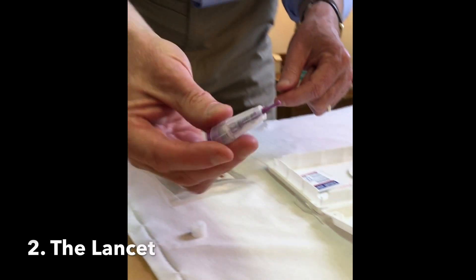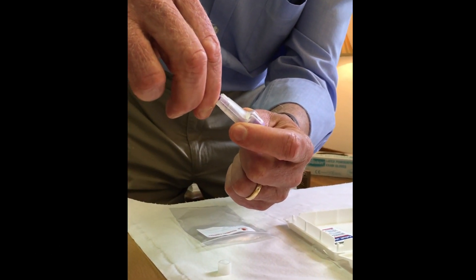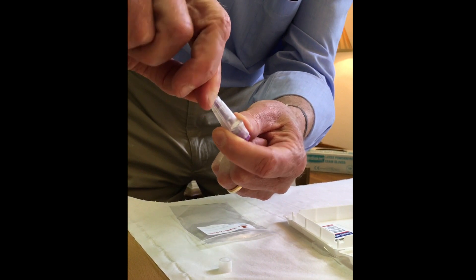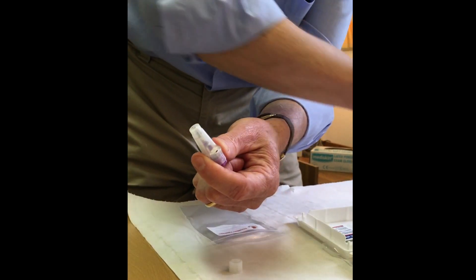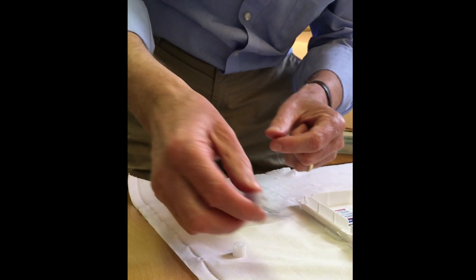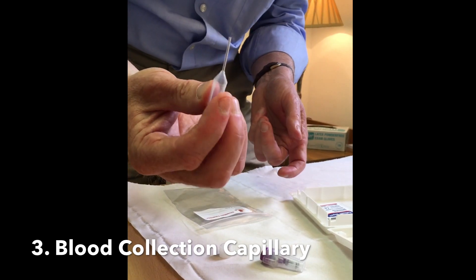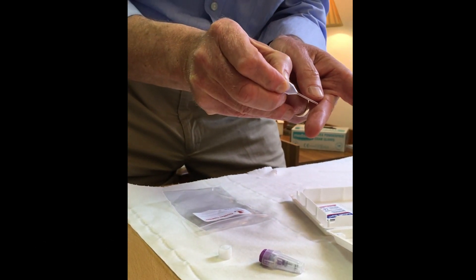This is the lancet. To prepare it, you twist off the cap only a quarter turn — from two o'clock to quarter past — pull away, and that prepares the spring inside. Then to fire, you press the button. This is the blood collection capillary.